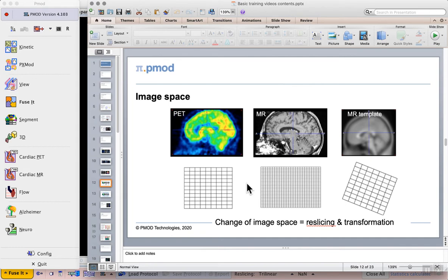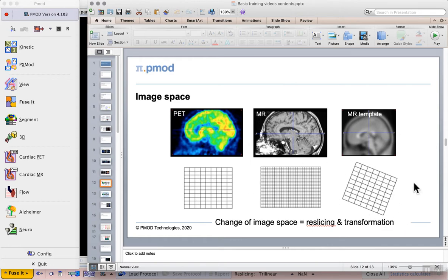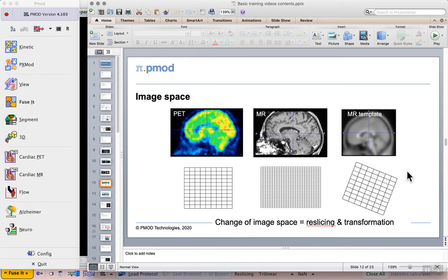If the image is acquired on a hybrid scanner they may have the same overall coordinate system meaning that the only real processing needed is the reslicing. But once we move to a template image we'll have a completely different geometry here shown with a simple rotation but in reality we have a complete warping of the shape since no two brains are the same shape meaning that we need an elastic transformation.